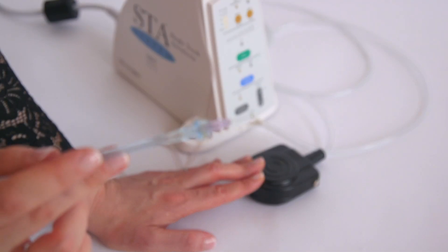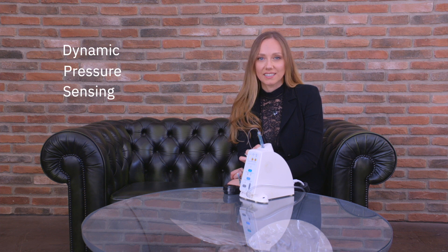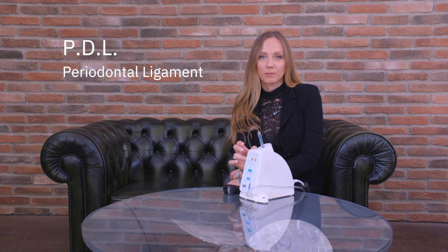When the machine says cruise, you can release the button and the flow will continue automatically, providing one drop of anesthetic every two seconds. The machine has a dynamic pressure sensing system that allows you to know if you are in the correct site for achieving an optimal anesthesia. You just have to stay there until the machine says PDL — periodontal ligament. This means you are doing your anesthesia in the correct way.